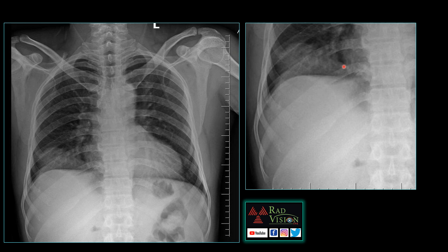I will zoom the image for you. This is the homogeneous opacity noted in the right lower zone and here you can see there is an eccentric faint rim of calcification. So there is a lesion underlying in the liver which is related to this homogeneous opacity. We will try to see what is this homogeneous opacity and what is the lesion in the liver. We will go for a CT for this patient.